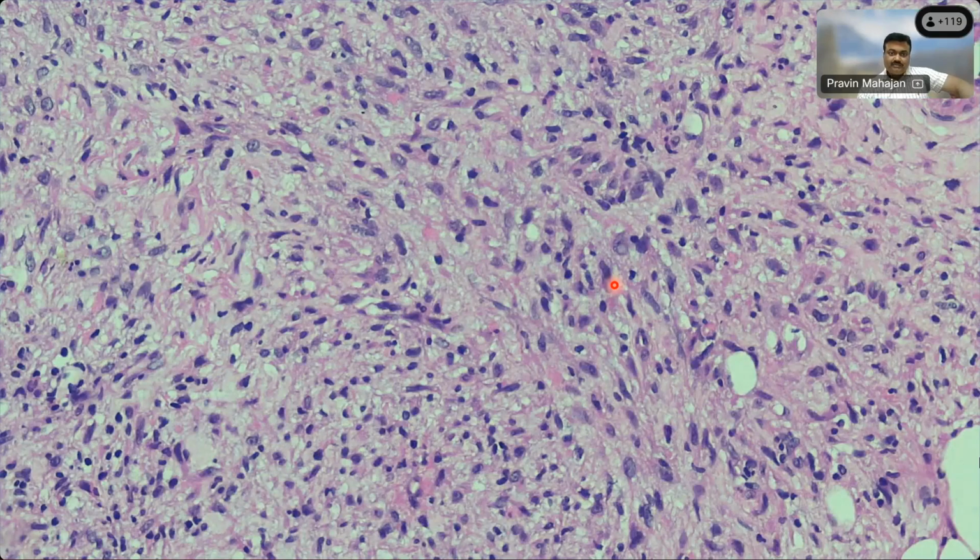What can you describe? So again, the same nuclear atypia is seen, hyperchromatism. Then the chromatin is actually more heterochromatic in places, more hyperchromatic. In places it is more open or fine chromatin. In some places it is vesicular also, with nucleolus. Can you see here? Yes, sir.